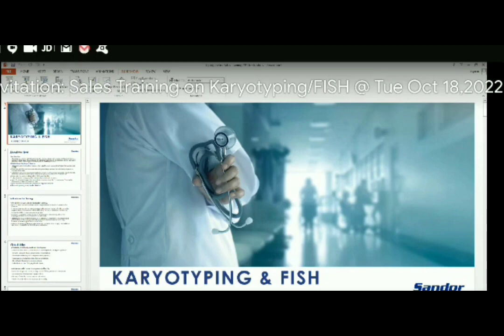But in some cases we'll get a culture in that also, but every time we won't recommend it. Very rarely, if some patient has only lithium heparin and doesn't have any other vacutainers at present, in that case we will recommend, but that too is a very rare case, and that too after discussion with me. After final discussion with me, only then I will accept, otherwise the sample will be rejected straight away.